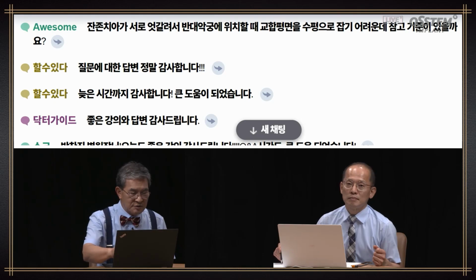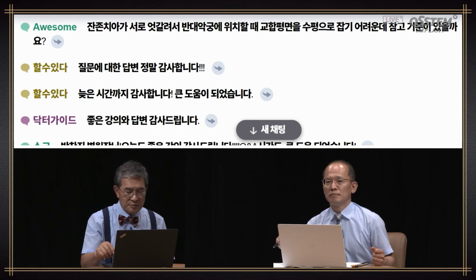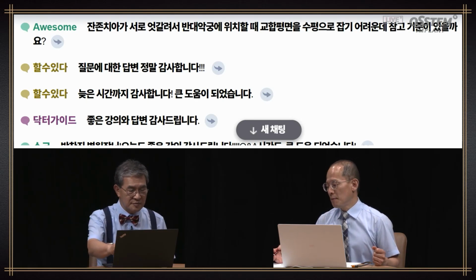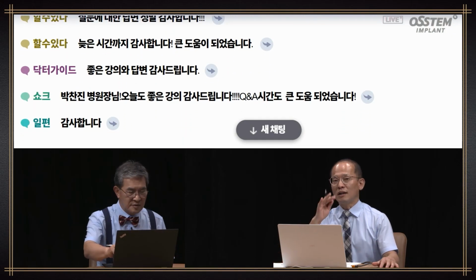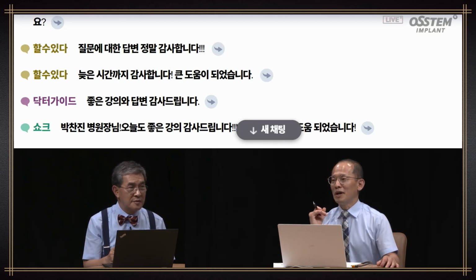Also, you mentioned the remaining teeth are cross-crossing. So having the occlusal plane flat is very hard because of the location of the opposing arch. What to do? Well, there are different ways. Camper's line, and in the mouth, a retromolar pad can be used. And also on the model, the hamular notch and incisive papilla extension could be used.